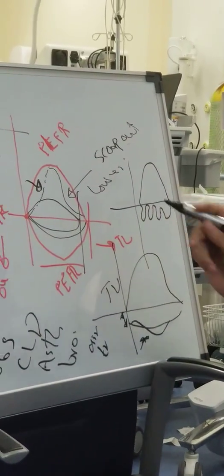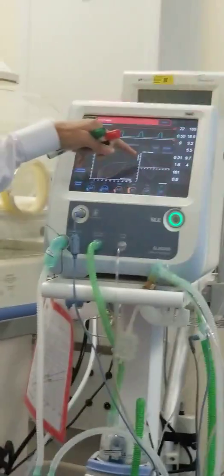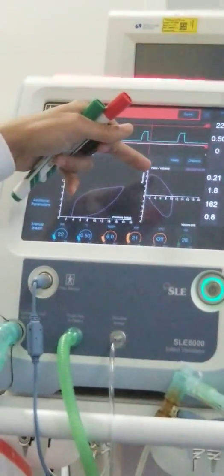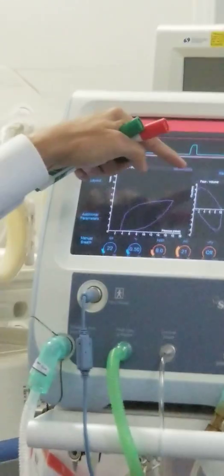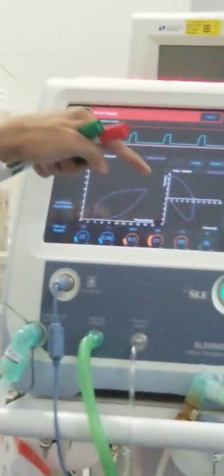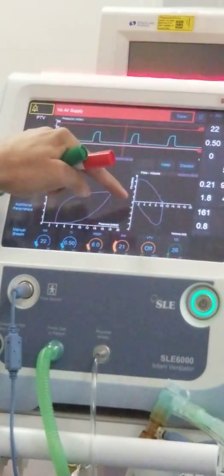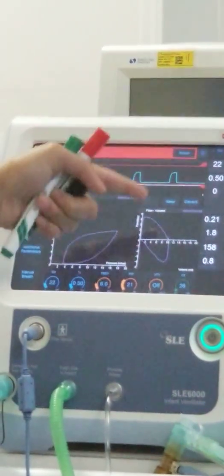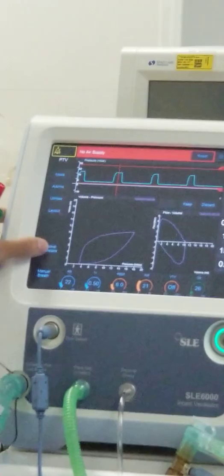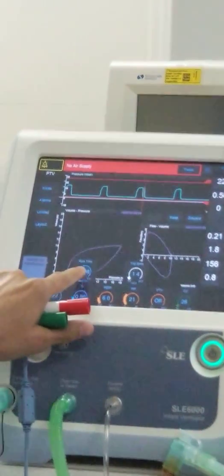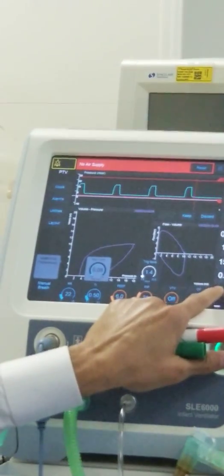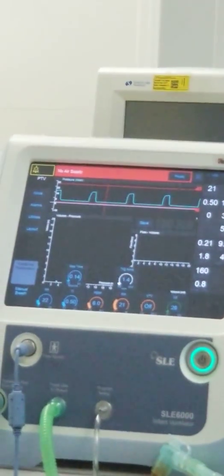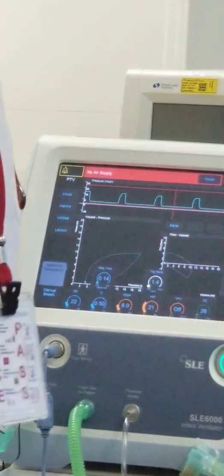It is also important to look at the peak inspiratory flow. If you can see it is reached very early, that means your rising time is very small — the rise from zero to peak inspiratory flow is too steep. It should rise more gradually. If you see this, you need to go to the ventilator settings and increase your rising time — for example, to 0.1 — and then you will see the difference.